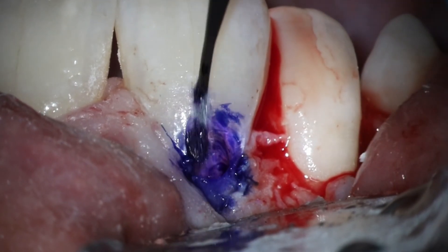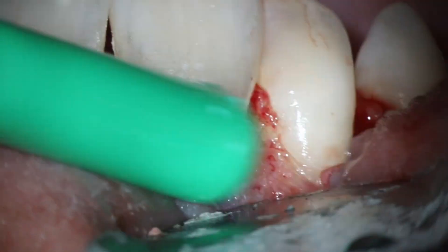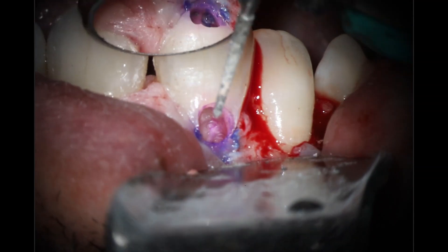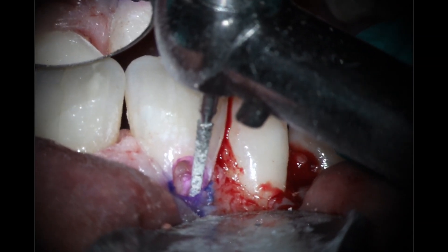Going back in again — this is a little tedious, but I knew I was going to be talking a little bit more than normal about resorption, so I'm okay to keep that in. It's still way down apically. At this point we are going down — you can see with the burr in a second, it's going down quite a ways to get that out.